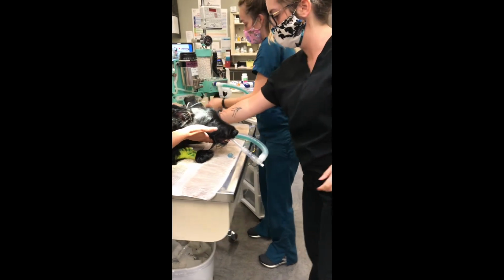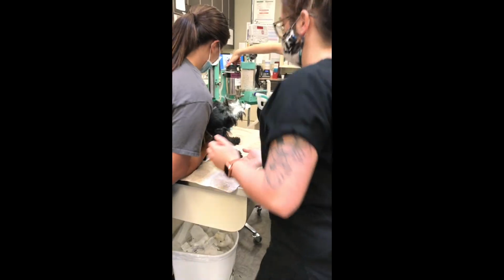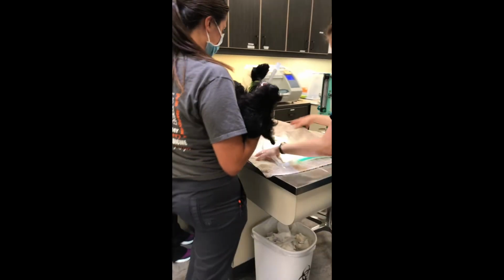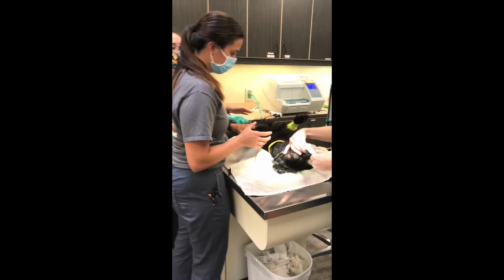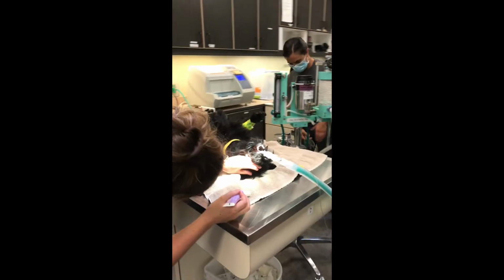And we're going to hook him to his back. I'm going to apply some eye lube while they're hooking him up.